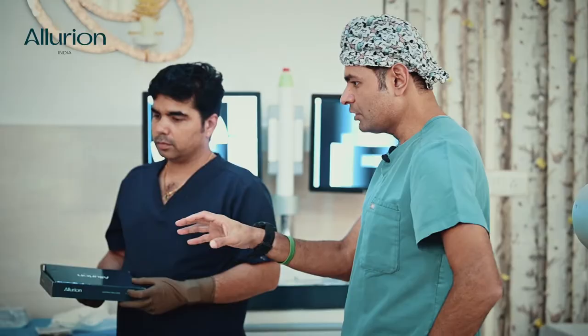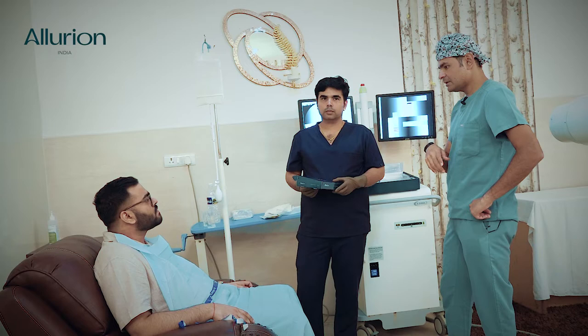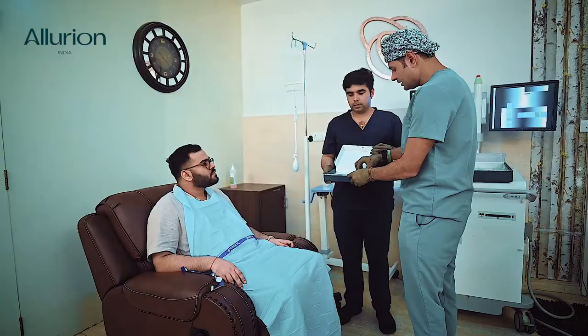The first step is I'll explain it to you, then I'll put the capsule inside, we'll take an x-ray, then once we've done the x-ray we'll initiate the filling, once the filling is done I'll again take an x-ray, and then remove the catheter. First step: demonstration. Second step: putting in the capsule. Third step: x-ray. Fourth step: filling. Fifth step: another x-ray. Sixth step: removal.